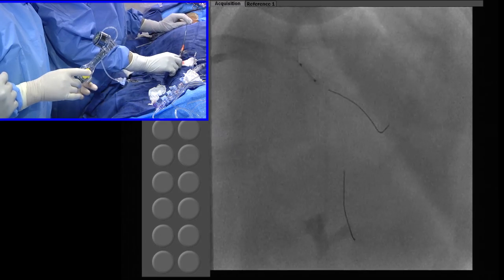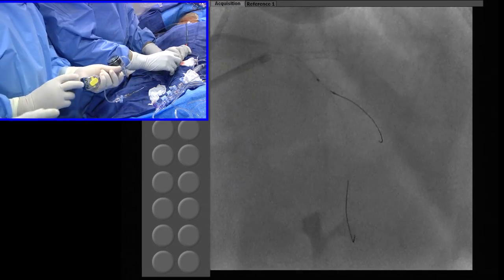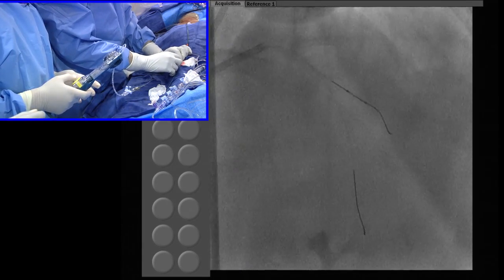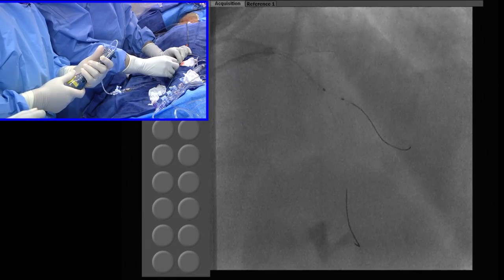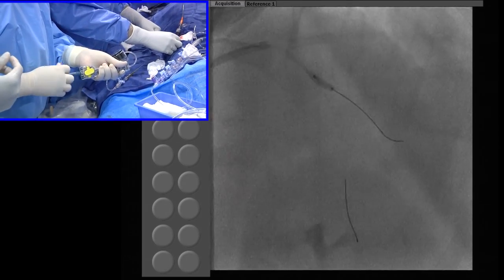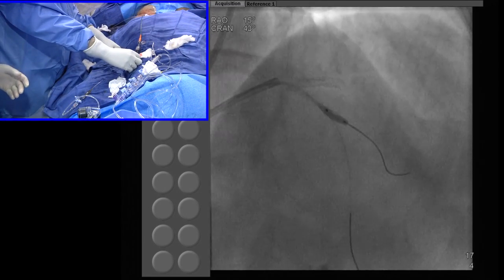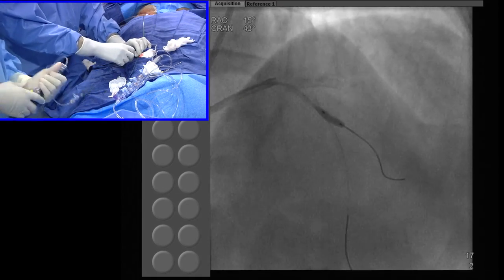Okay, try. So we are going. Okay, went in. Good, good. Okay. Go up now. Yeah, open nicely at 8 atmosphere. Okay. You still see that chunk? Yeah, down, but open nicely.